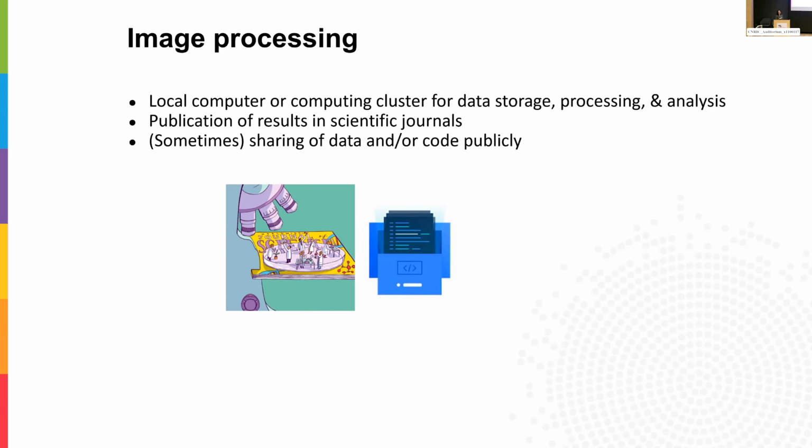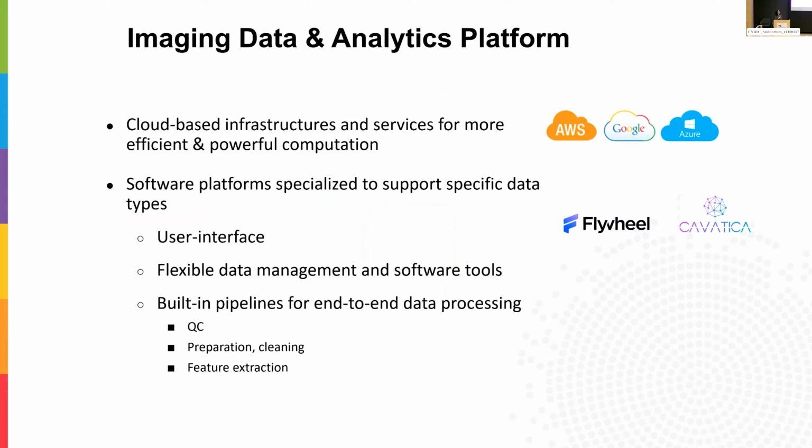So it's not reproducible. It's not generalizable. You typically can't just pick up files and plug them in on your own system. And so with the progress of building out large-scale imaging data sets, there was a realized need, and a lot of groups quickly moved towards implementing cloud-based environments and using cloud services for their strong efficiency, their computational resources, as well as the development of software platforms that are specialized to analyze these specific data types.